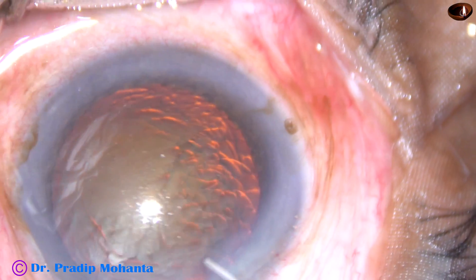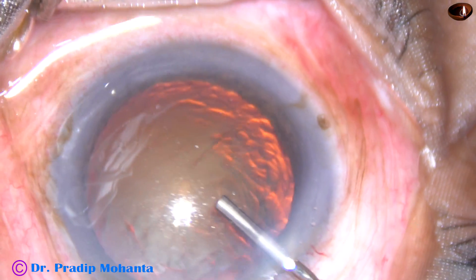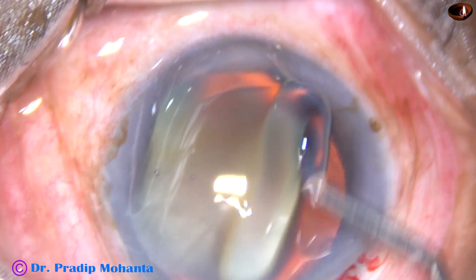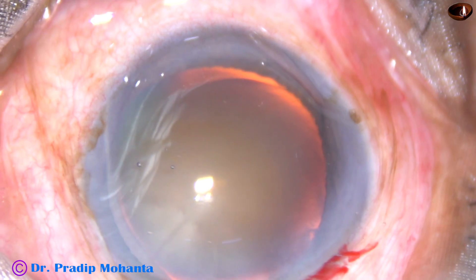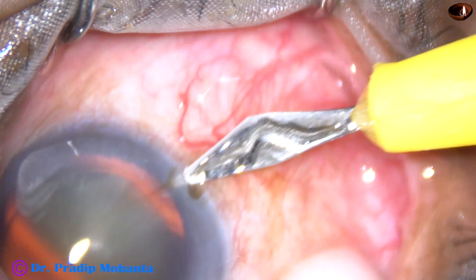This is Supra-coat from Appasamy Associates. It's a combination of chondroitin sulfate and sodium hyaluronate. Beneath this, I have injected HPMC. HPMC has been spread over the corneal epithelium.